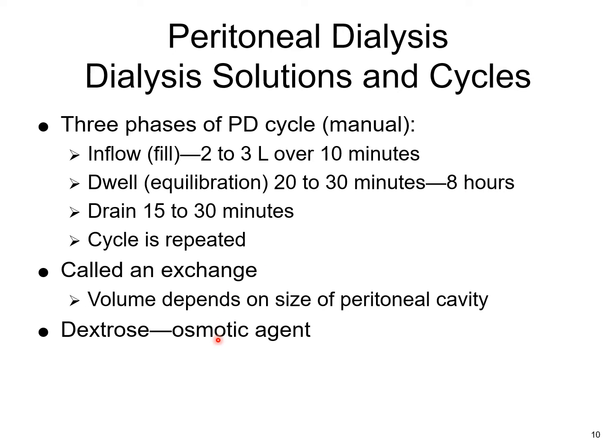So sugar, once again, is an osmotic agent that's put in the dialysate to basically pull out some of the junk, especially the water.